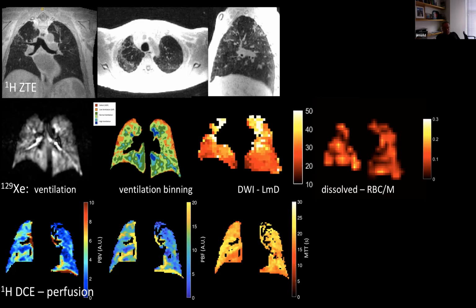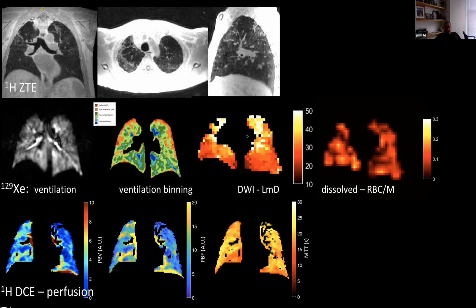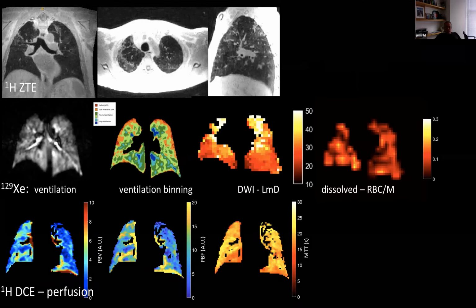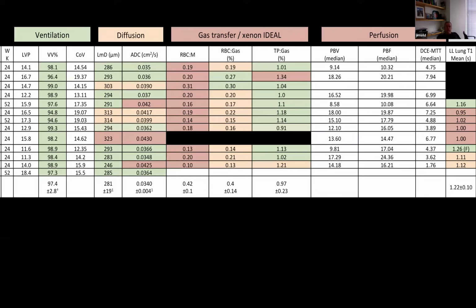Again, with the xenon ventilation MRI in these patients, we do see elevated intercept and diffusion-weighted parameters. They are changing where you've got architectural disruption and structural change in the lungs. We see elevated diffusivity, and again, quite impaired xenon red blood cell membrane signal. And interestingly, in these patients, also some more heterogeneity in their perfusion parameters, because their lungs are generally more structurally heterogeneous. So there are some example maps.